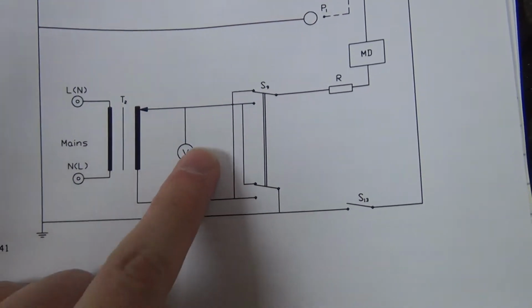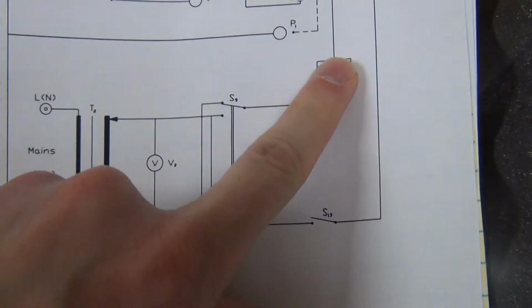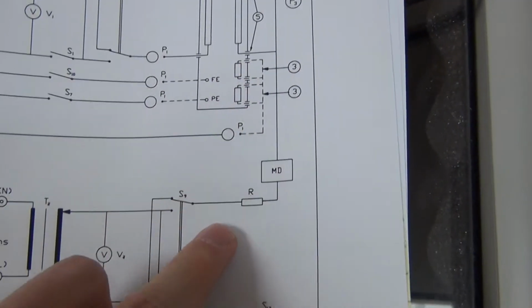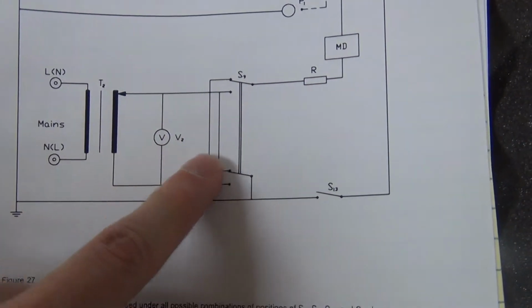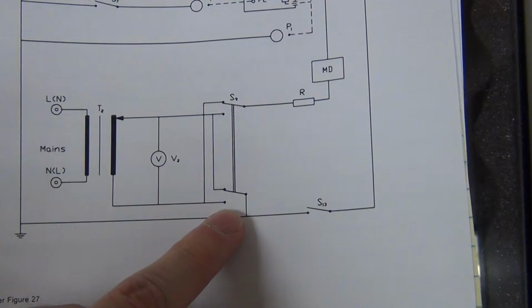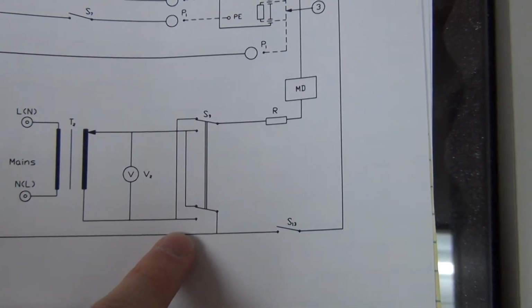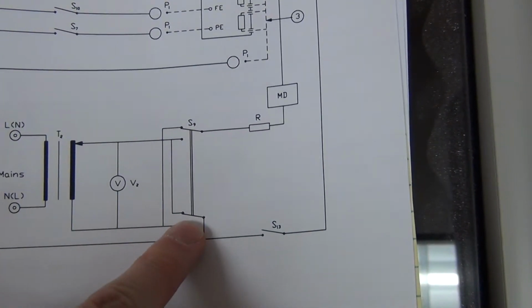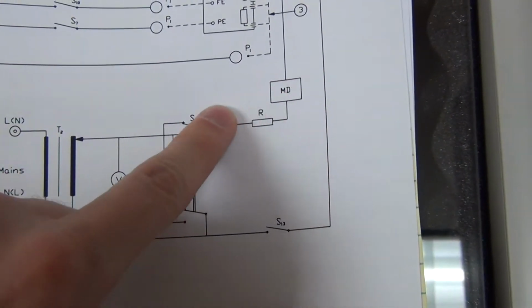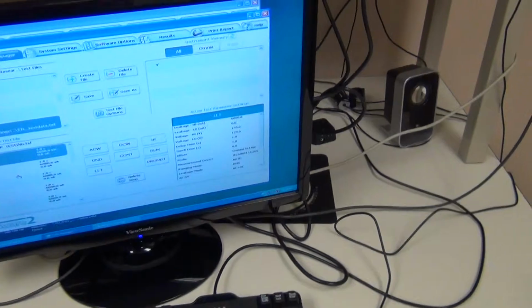So here we can see T2, and we have line, neutral, going through a resistor, through the measuring device, and back up to the patient lead. Well, at the same time as running line through this resistor, I need to tie neutral in to my protective or reference point. So by putting them through 2 separate scanners, I have the capability of tying these points together without including it in the measuring circuit. So that's why I've used 2 scanners in this instance, essentially to provide isolation.